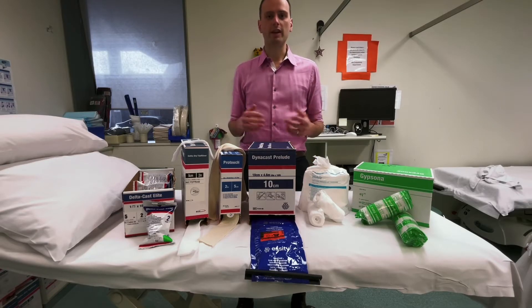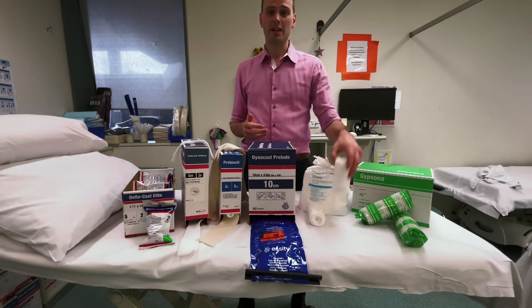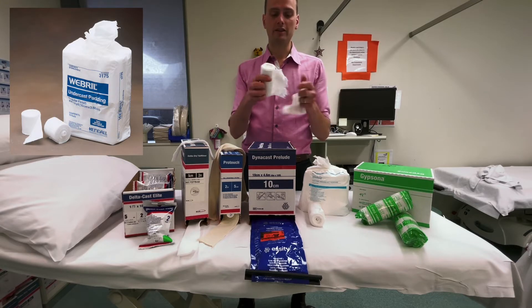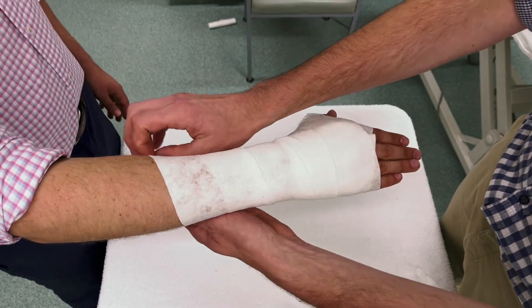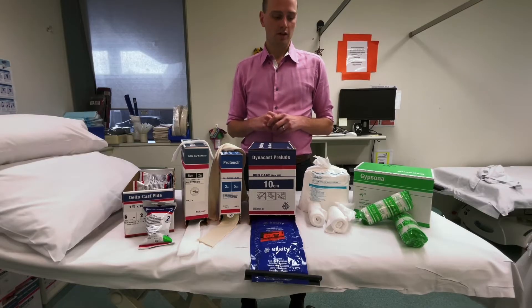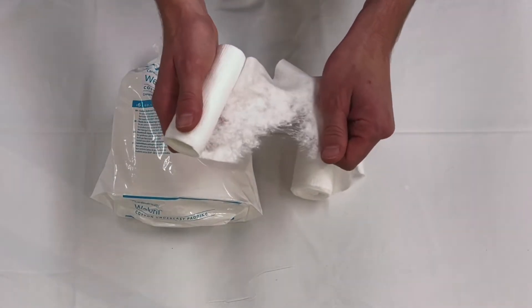The first thing we do when we put a plaster on is put the under-padding on. In most ED departments as well as theatres we'll typically go straight to what's called a padding like Webril. This is a tearable soft layer that we wrap around the limb circumferentially, going beyond the layers of the plaster so we can fold it back over at the end. Webril is the most common type — it has a good conforming nature and tears easily.